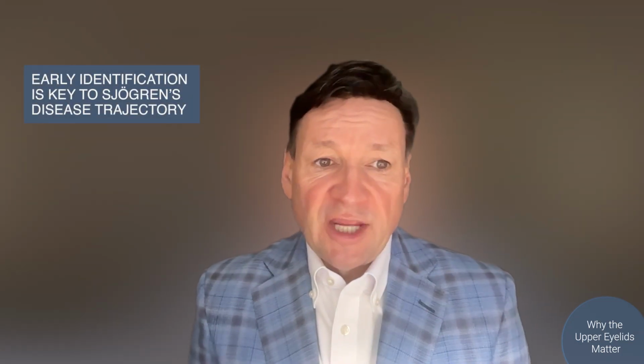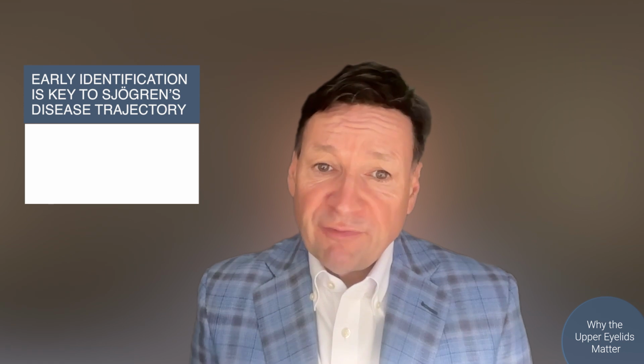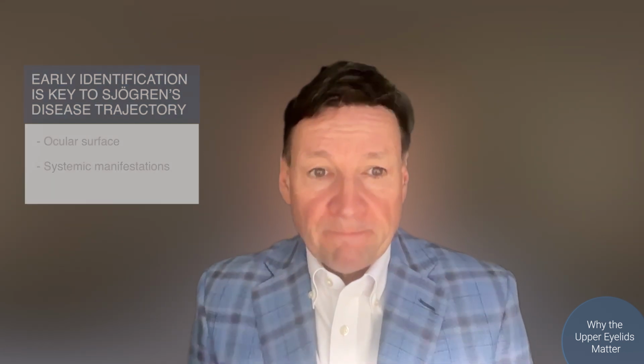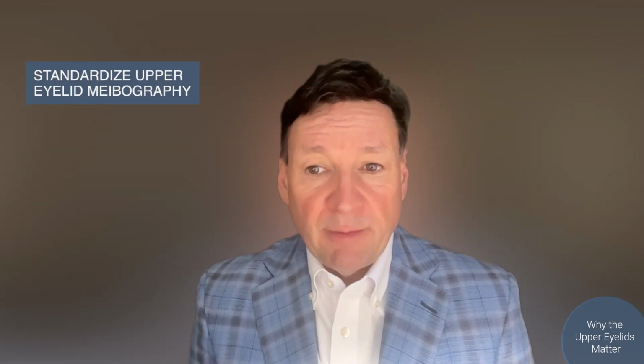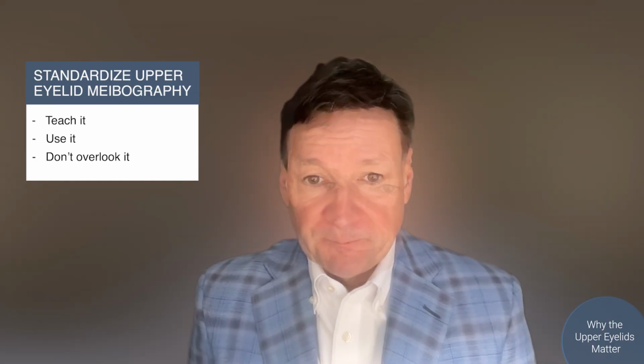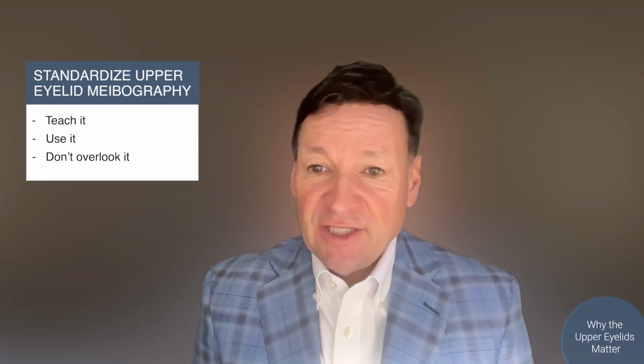That imaging pattern alone does not diagnose Sjogren's disease, but it raises my index of suspicion and prompts referral for serological testing and a rheumatology evaluation. Early identification can change the trajectory of disease, not only for the ocular surface, but for systemic manifestations as well. For those of you who train residents and fellows, consider making upper lid meibography a standard part of your teaching on autoimmune dry eye. It is a clinical pearl that many training programs still overlook.